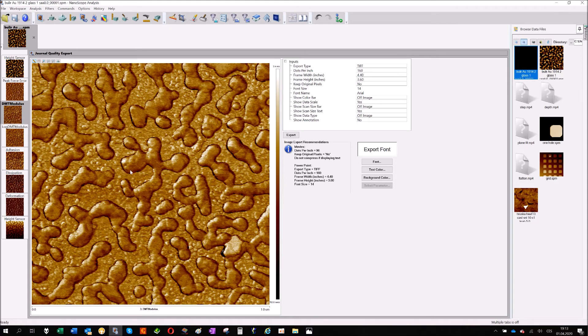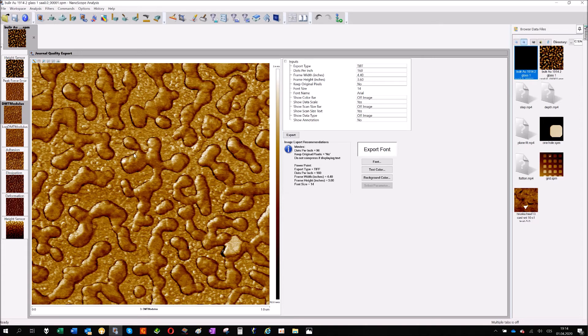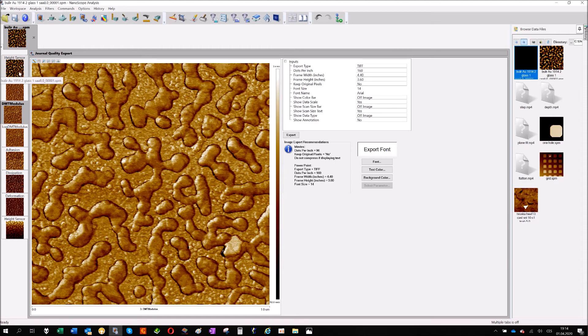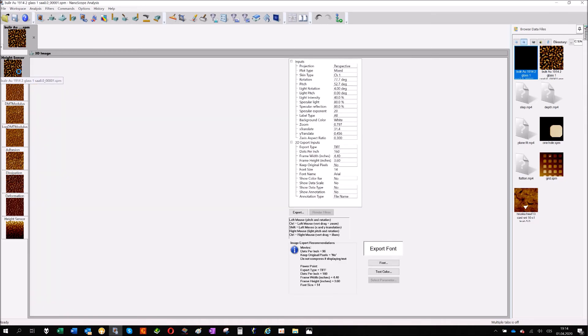So even if the sample here probably doesn't have any difference in height changes, because of the different contact area here around the edges you have some contrast. And what you can do is that you can prepare a 3D map.